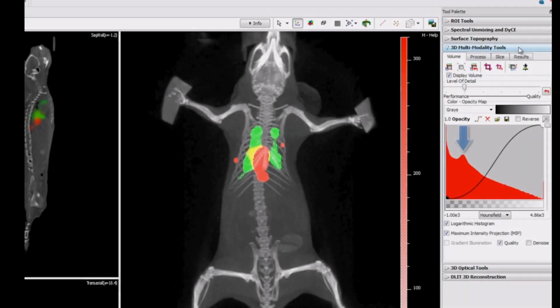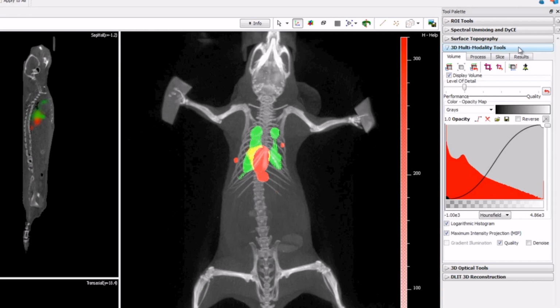On the far left of the histogram are voxels of low density with lower Hounsfield units. And on the far right are voxels with the highest density corresponding to higher Hounsfield units. The default view is a blended view showing some low-density voxels and some high-density voxels.